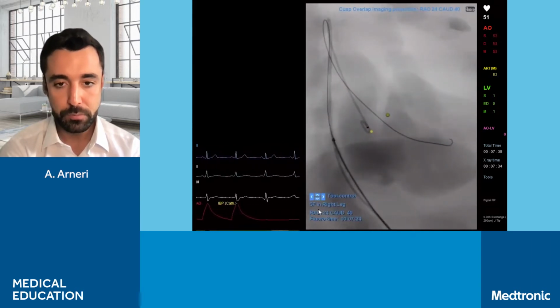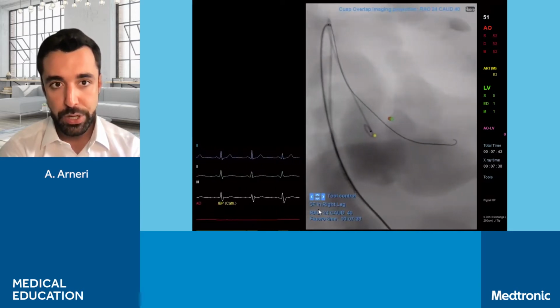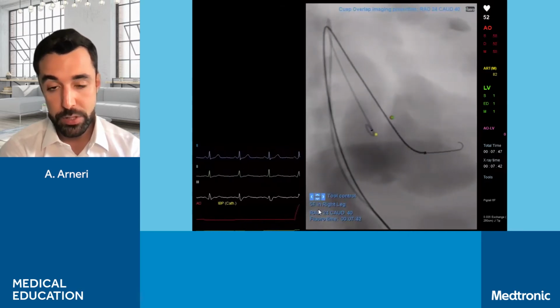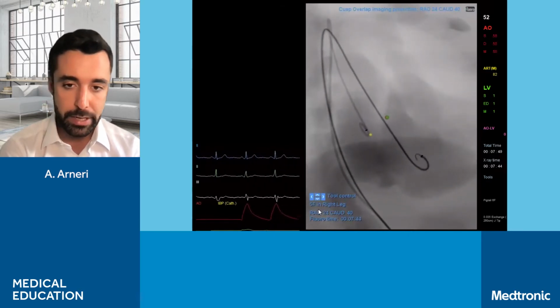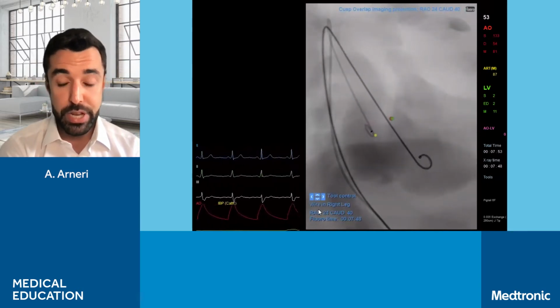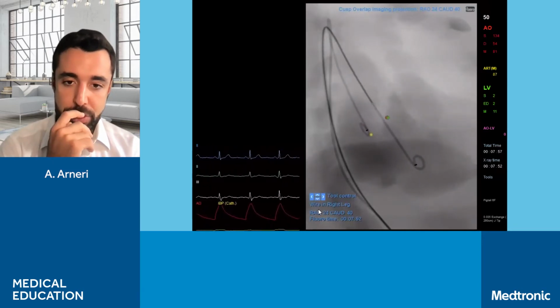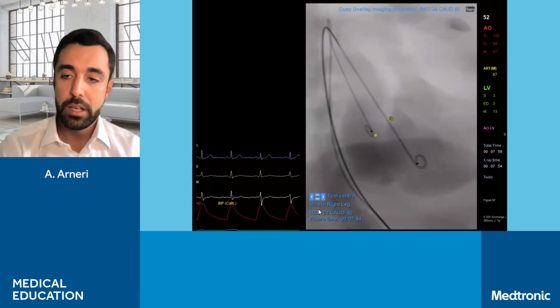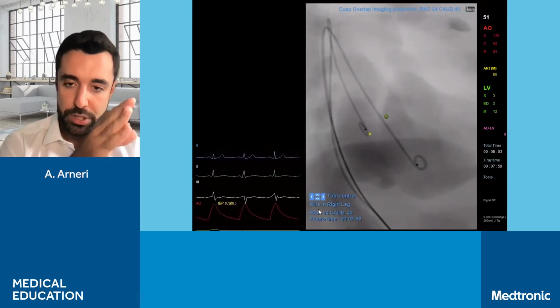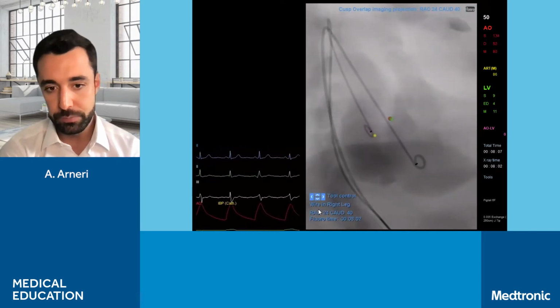Okay. Why are we using the pigtail now? First of all, because we want to measure the pressure both in the ventricle and outside the ventricle to see the gradient and to see the index for aortic regurgitation, but also because of the shape of the pigtail. That's the best to check if we're not stuck in the mitral valve, and also that's the best tip shape to insert the pre-shaped guide wire into the ventricle.